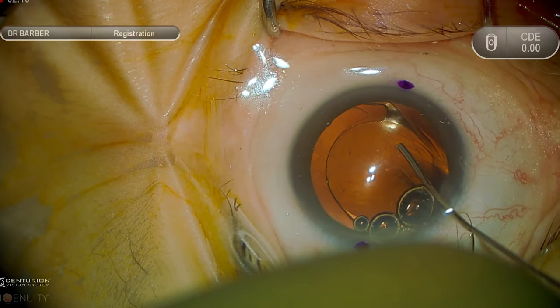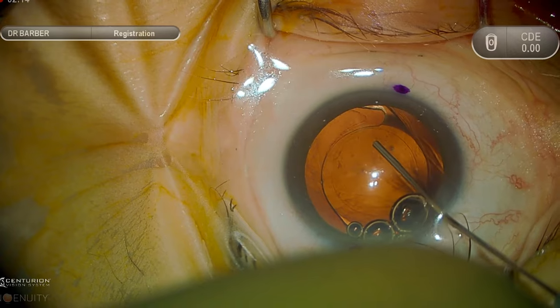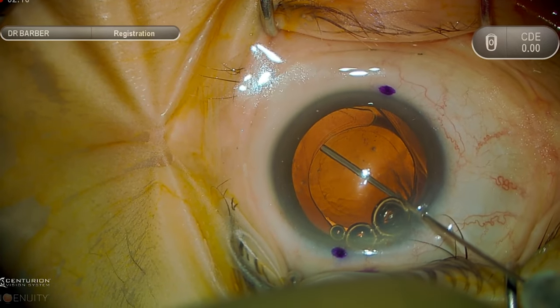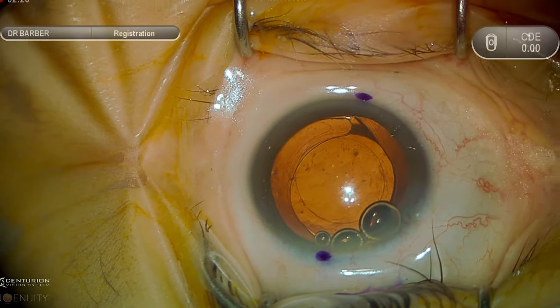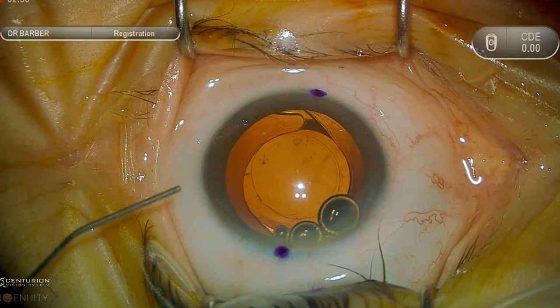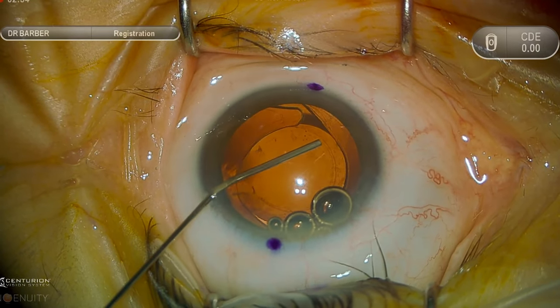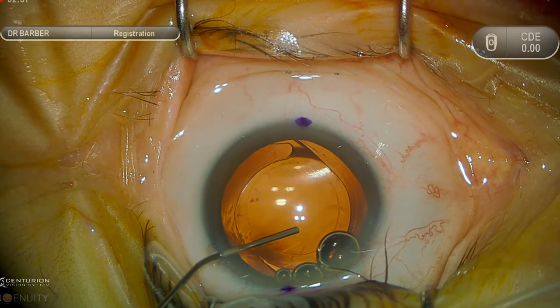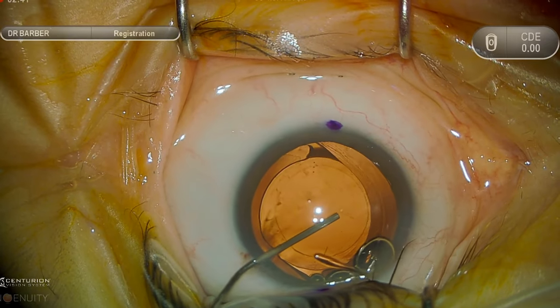You can see here we're carefully dissecting the anterior capsule from the anterior surface of the lens implant. This viscodissection is the most effective way for cases such as this where there's minimal capsular fibrosis. With the Alcon lens, the terminal bulb at the end of the haptic is where the capsular fibrosis tends to accumulate the most, so visualizing that and being aware of it is crucial.